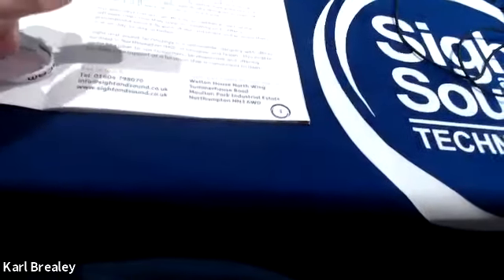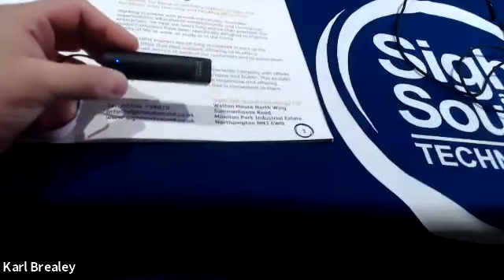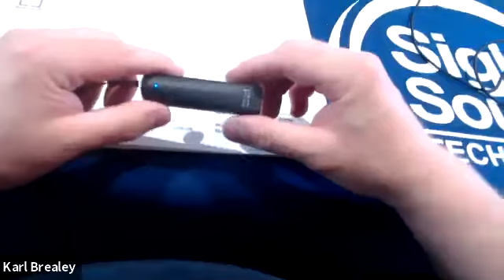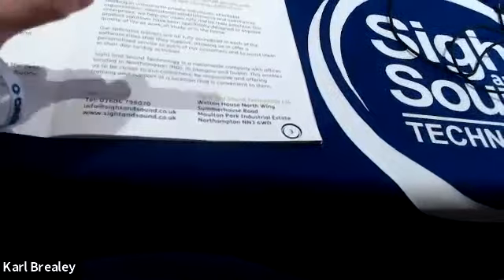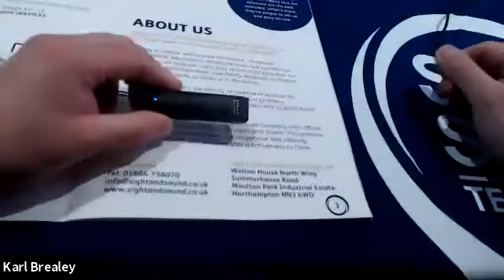Its predecessor had a 4-inch by 1-inch unit with about another 3-inch battery pack connected via quite a thick cable up to a camera arm. So obviously, as you'll be aware, these units have changed massively. It went from a version 1 to a 1.5, where they changed the camera units a little bit and the connections, onto this version 2, which, as I say, is phenomenal for what they've done. So basically, the first and foremost point of this device was to read printed text.